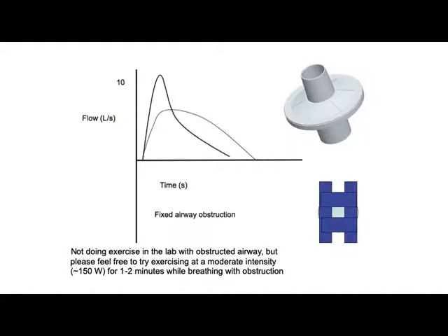The first part of lab will be just assessing the flow volume loops. You're going to do the forced vital capacity test a number of times. I did a few of them at different stages during exercise. So this is a trace that I generated while making the lab book. You can see the resting forced vital capacity test here. Looks pretty normal. I was happy about that, although this was like two or three years ago. But it shouldn't have hopefully changed too much. So the blue is a resting scenario in every case. And then I was interested in how the flow volume loop changed during exercise. So I started the flow volume loop protocol at stage one, stage two, stage three. And these are typically low, medium, moderately high exercise.